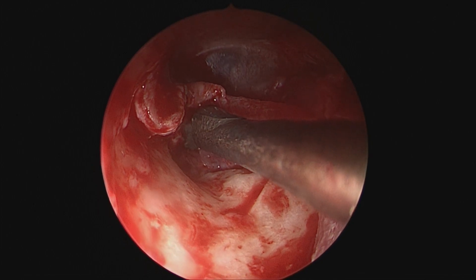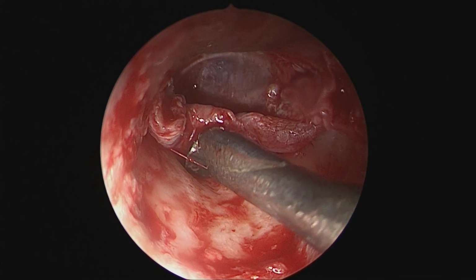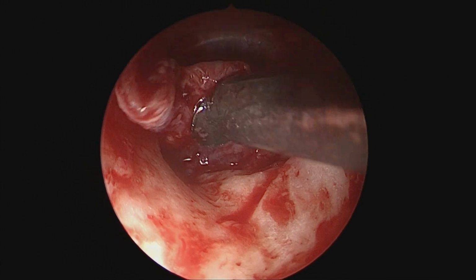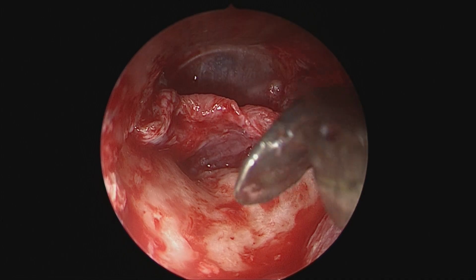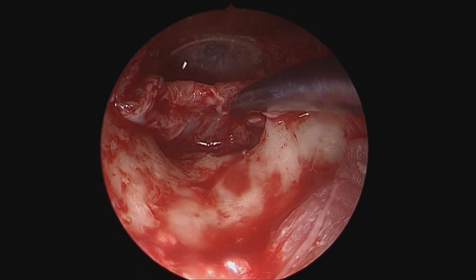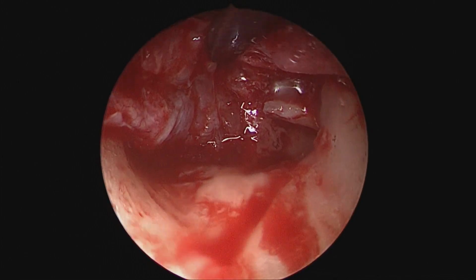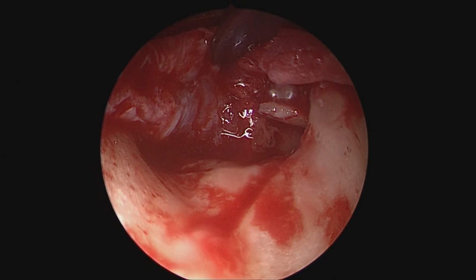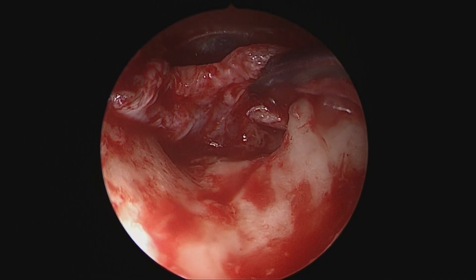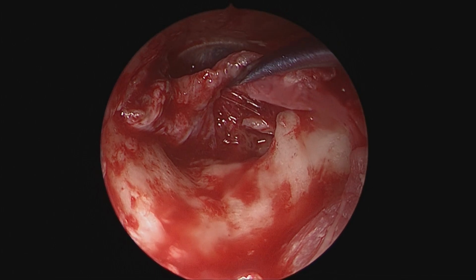And so posterior inferiorly, we still have some canal skin to raise. You can see a little hump due to which it takes a little bit of time. In a standard endaural or a postaural microscopic approach, this hump would surely need drilling to be able to see medial to it. And immediately what we can see as we go deeper is that the incus is already eroded. We can see the long process already eroded. The lenticular process is not there. And there is no contact between the incus and the stapes.